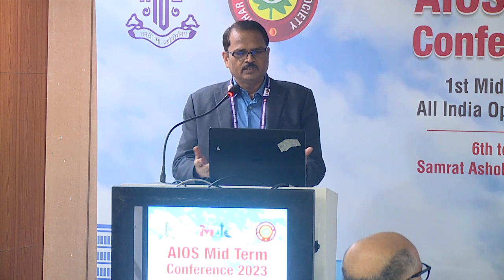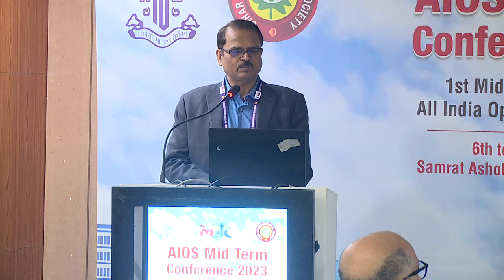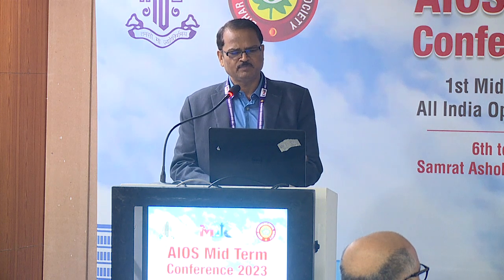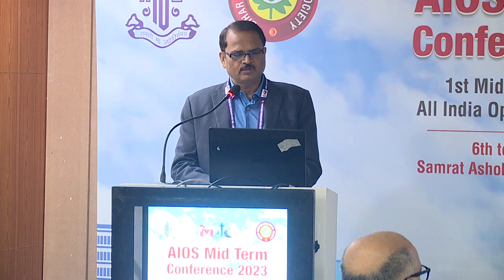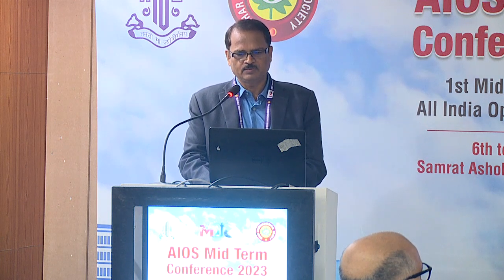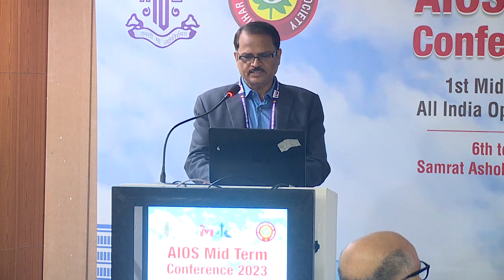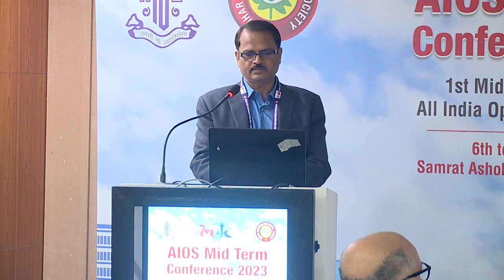So how to confirm? Clinically you can see it on the slit lamp, and sometimes, just for demonstration purposes, you can do an anterior segment OCT, simple imaging. If the cataract is total or dense, you can take the help of UBM or routine B scan. You can see here there is a PC defect in this UBM.